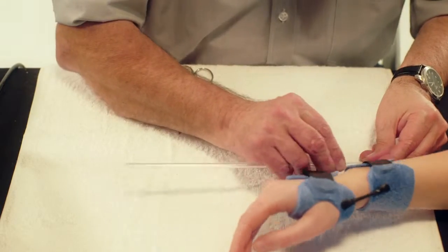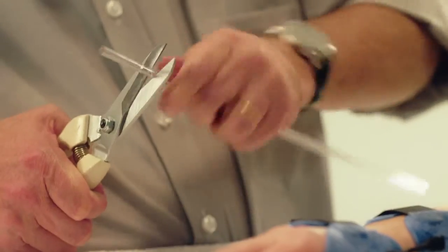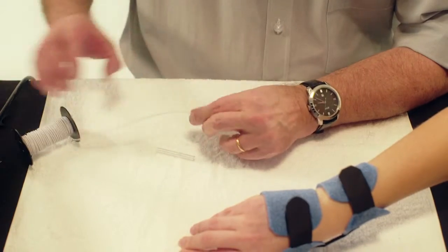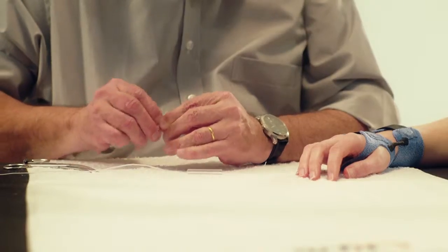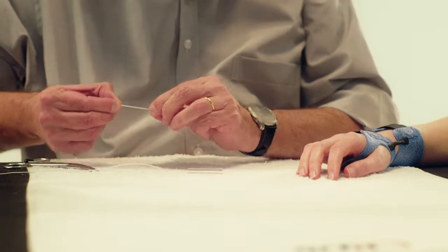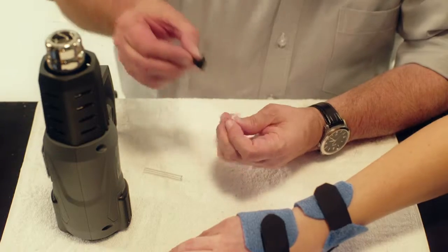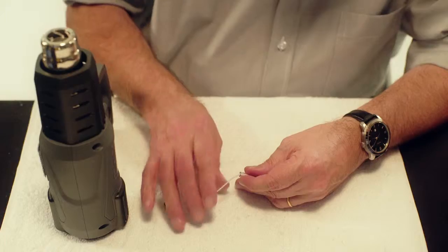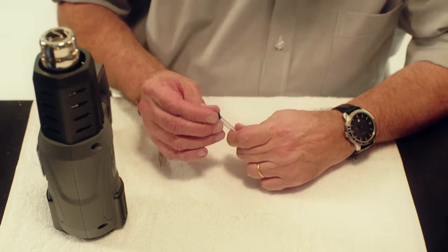Take one Orfitube. Cut the Orfitube to the right length. Take a piece of elastic thread. Make a knot on one end of the thread. Heat a piece of Orficast with the heat gun and roll this over the knot to secure the knot. Pass the elastic thread through the Orfitube.